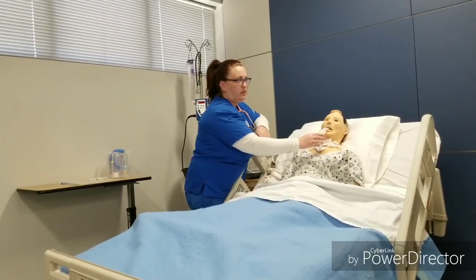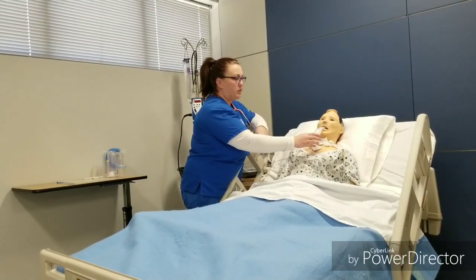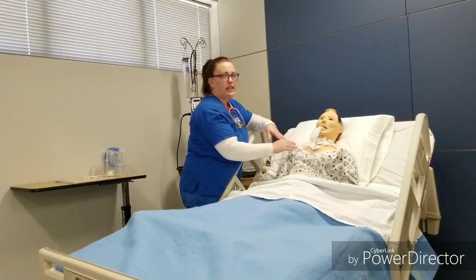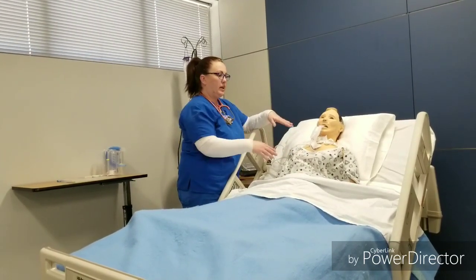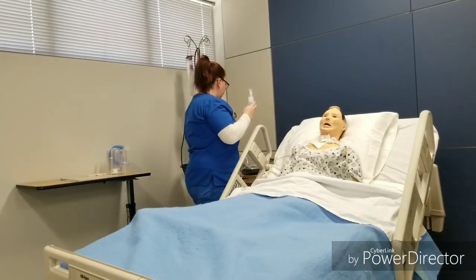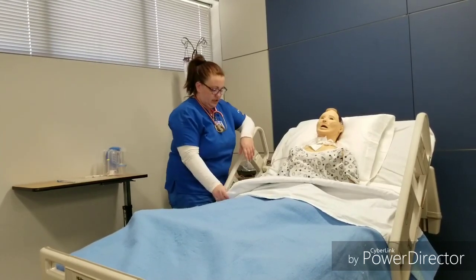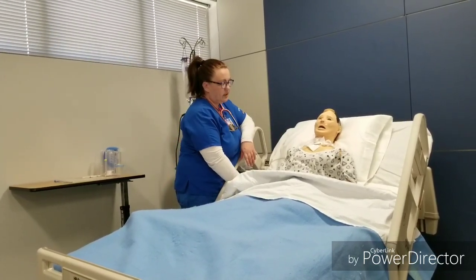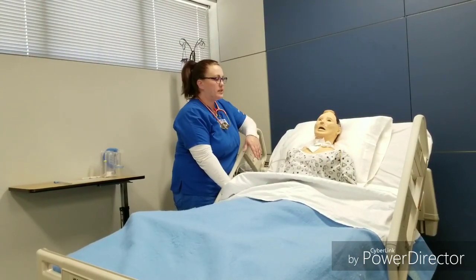This could take anywhere from 10 to 15 minutes. If your patient is unable to perform this task by themselves, then you stay in the room and help them, but if they can do it, you can leave the room and come back and check on them. Alright, treatment is over. Turn off the machine. Reassess the pulse. It is not raised over 20, so I do not need to notify the physician.